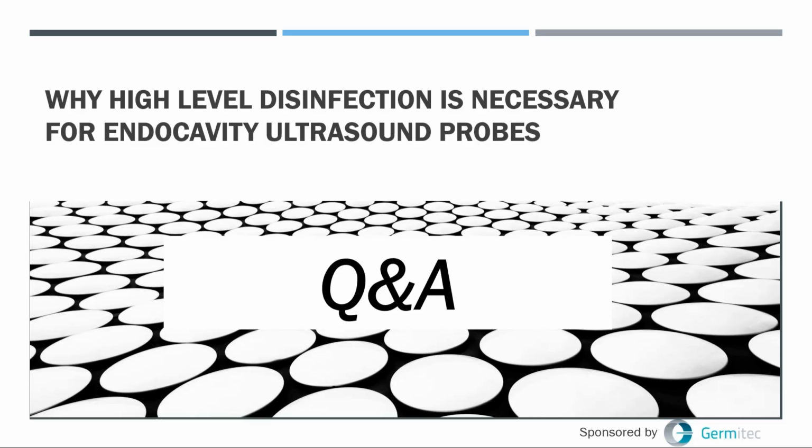Okay, next question. What is the correct method to clean and wipe the probe? Any specific way of cleaning? So here I cannot give you absolutely specific guidance on cleaning. I'll give you some general guidance. You need to look at, for your high-level disinfection method and the exact probe, what the manufacturers recommend for the cleaning method. That is, what type of specific wipe they use, or is it an immersion into water, or is it put into running water? So I can't give you a specific cleaning method.